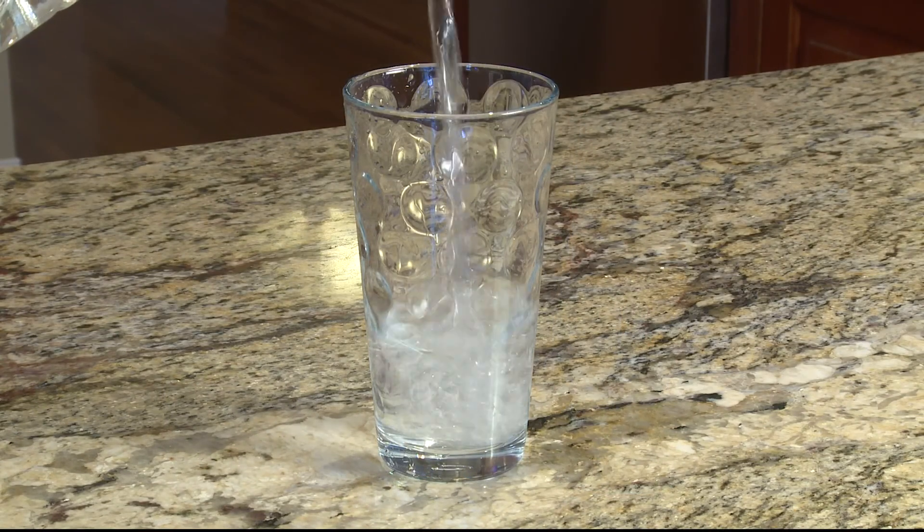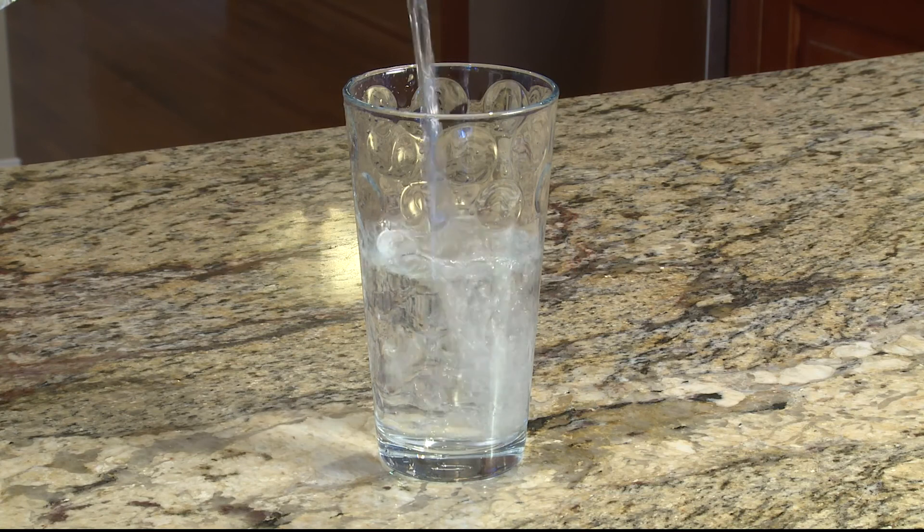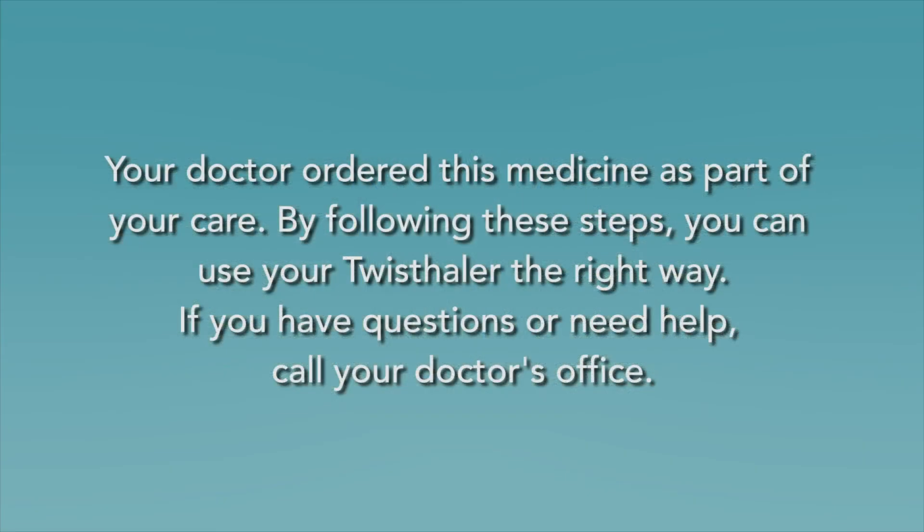Remember to rinse your mouth with water after every time you use your twist haler — this helps you to not get sick. Your doctor ordered this medicine as part of your care. By following these steps, you can use your twist haler the right way. If you have questions or need help, call your doctor's office.